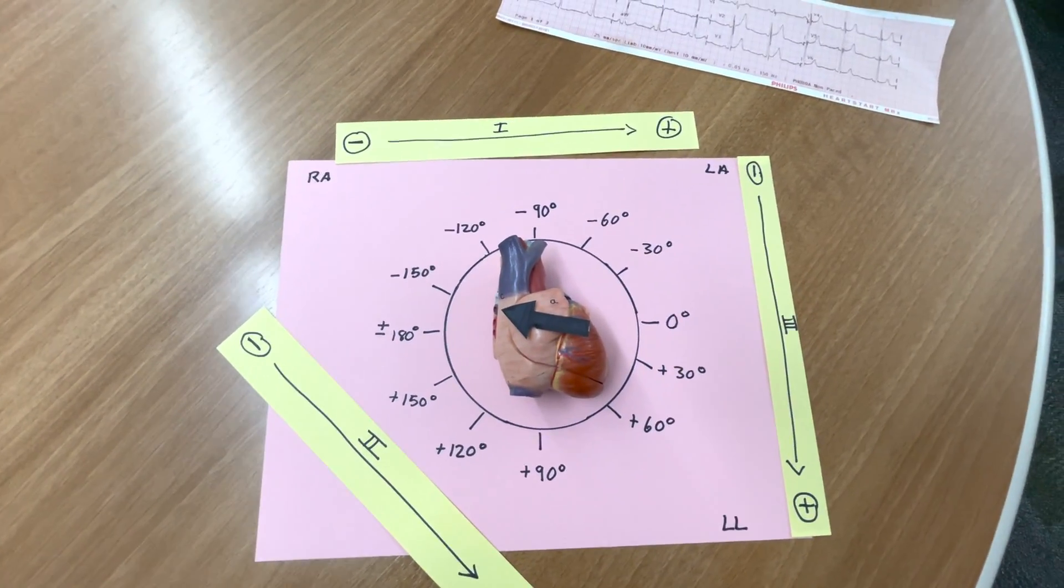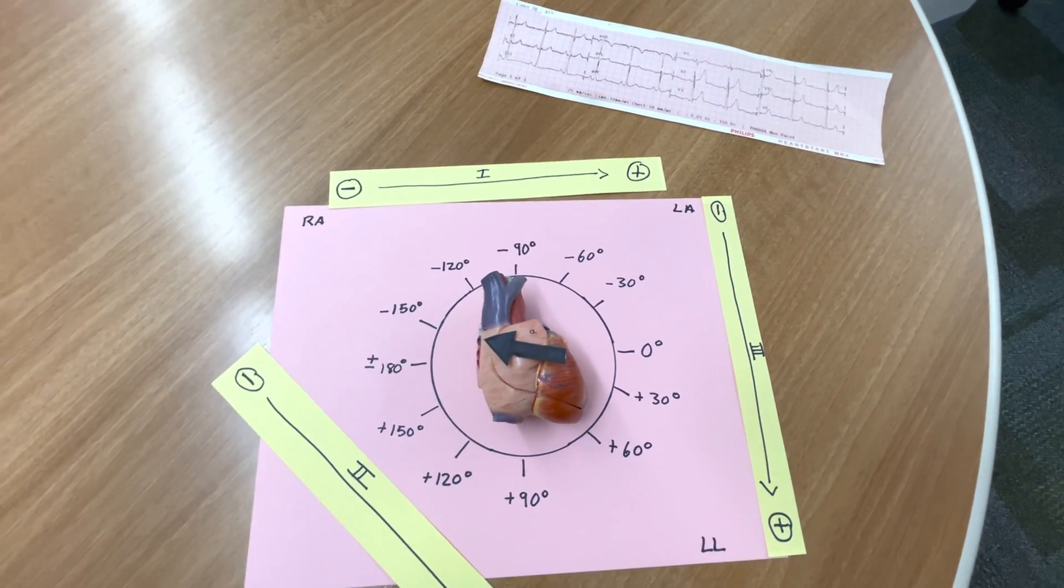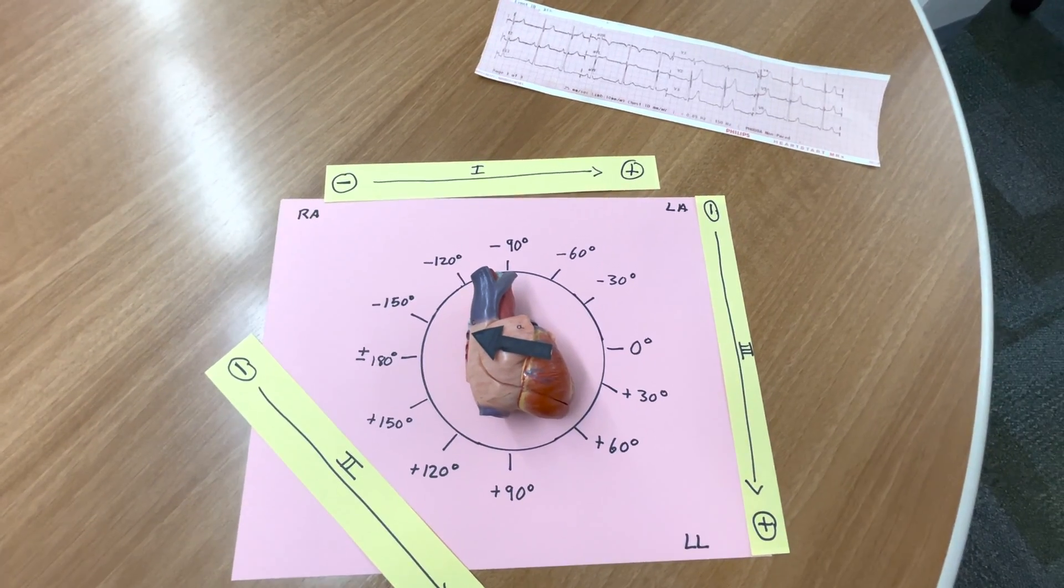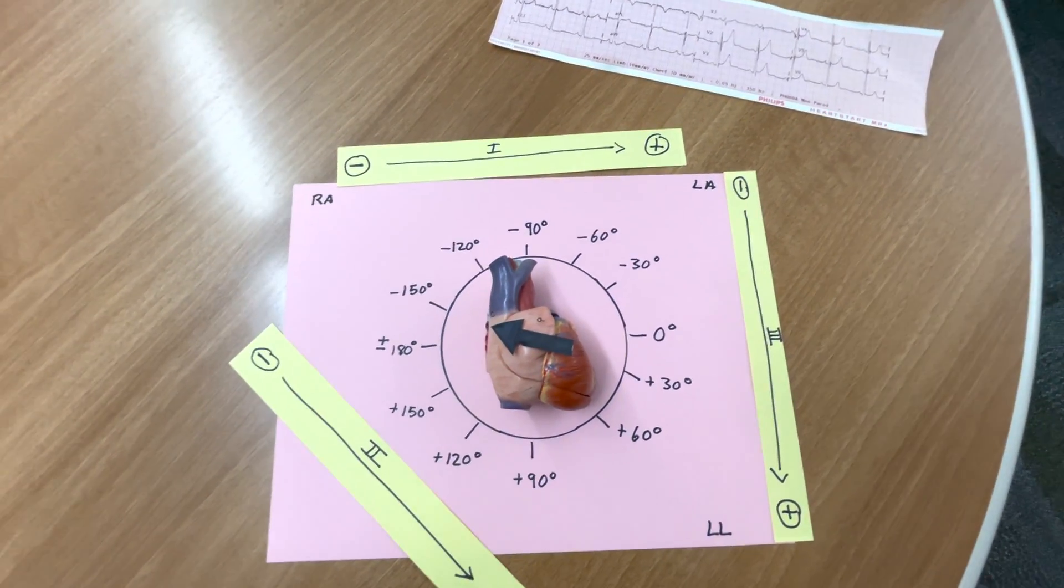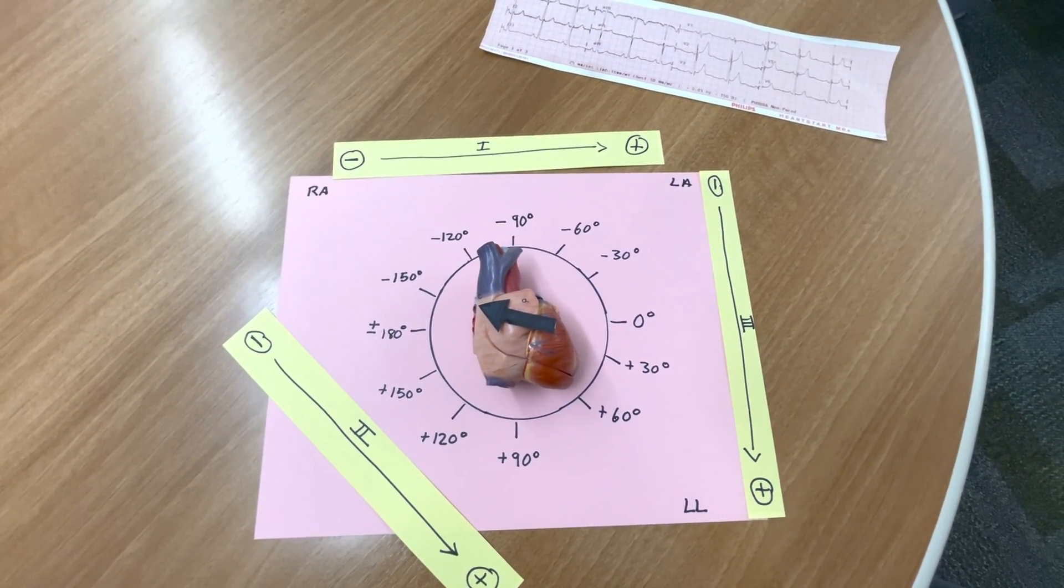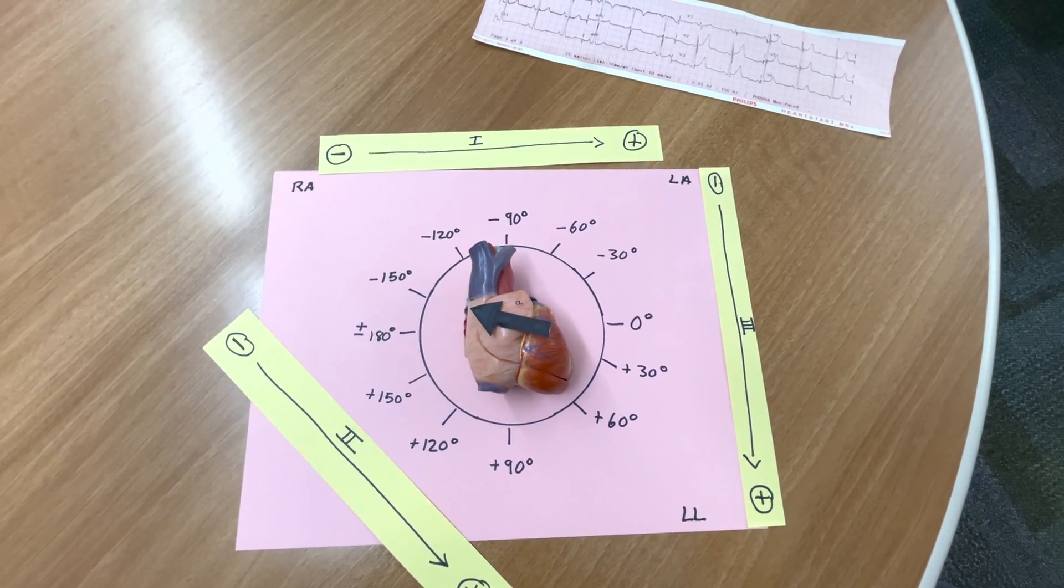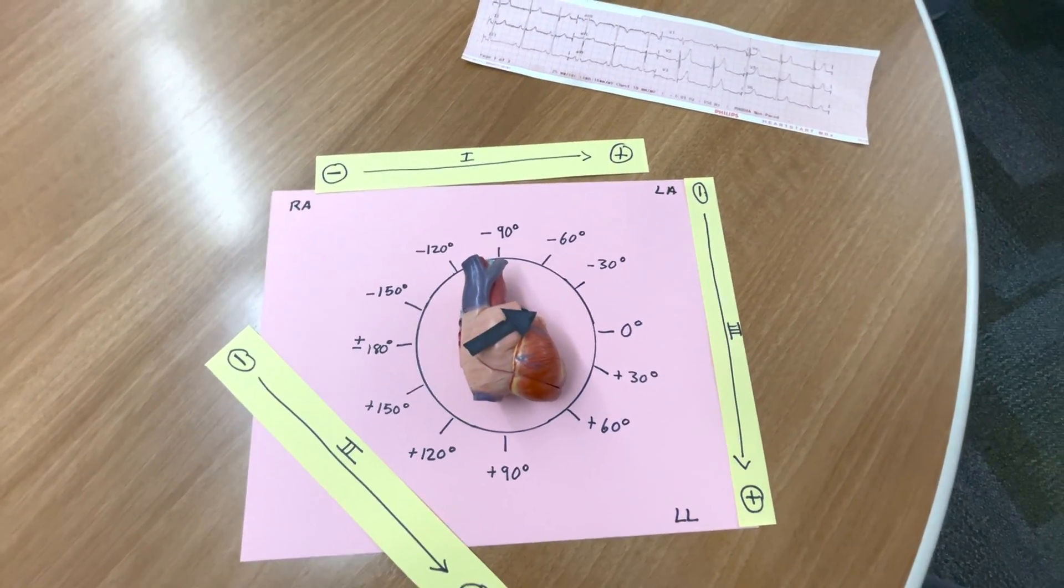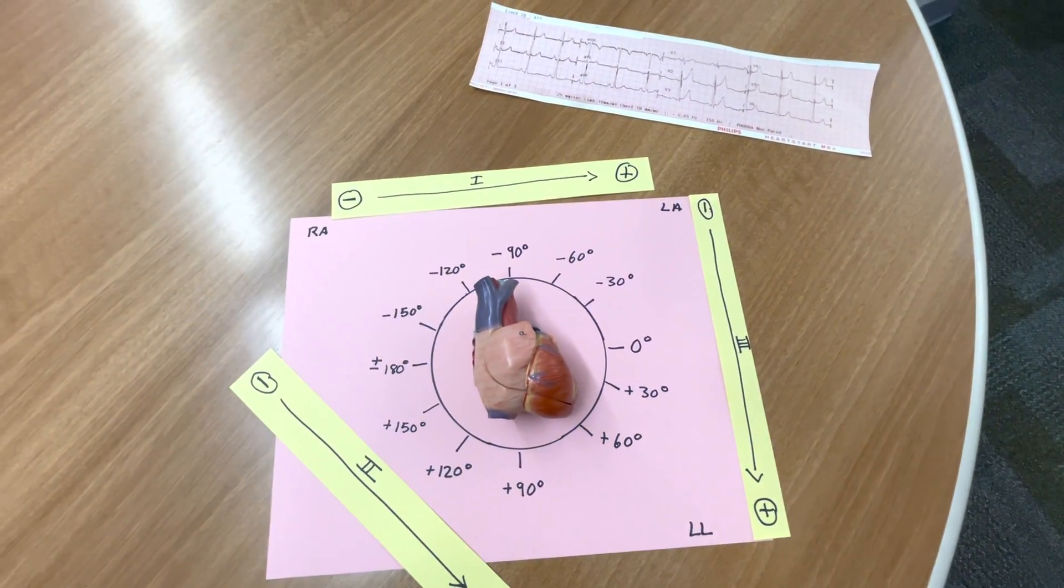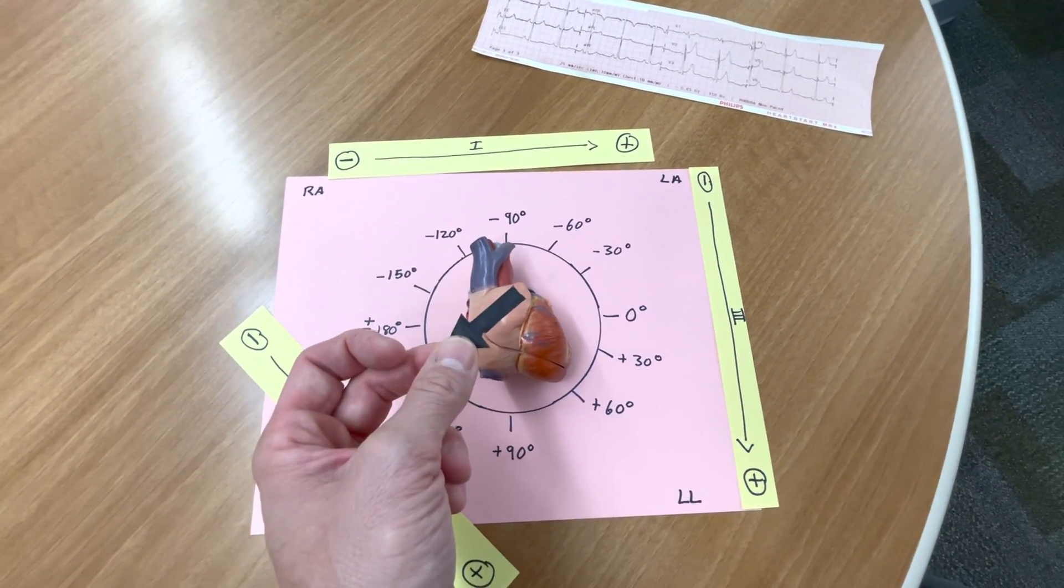What are some things that cause right axis deviation? Think of right bundle branch block, right ventricular hypertrophy as opposed to left ventricular hypertrophy, pulmonary disease. There's a certain type of right-sided heart failure called cor pulmonale that causes right chamber enlargement that can cause right axis deviation. Incredibly thin people can sometimes develop right axis deviation. And left posterior hemiblock can cause right axis deviation as well.